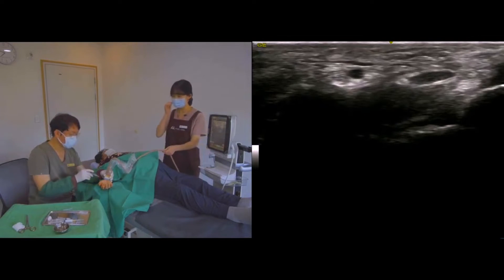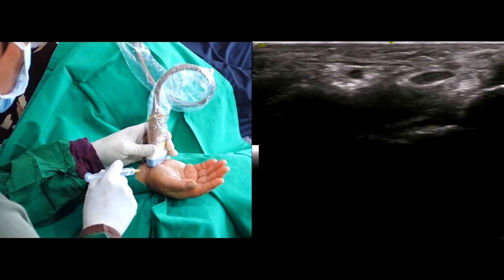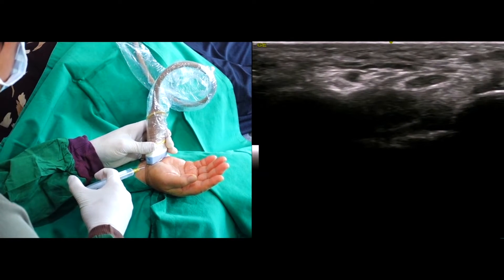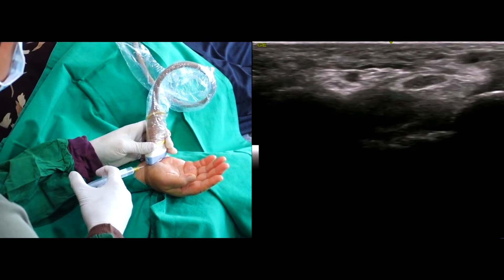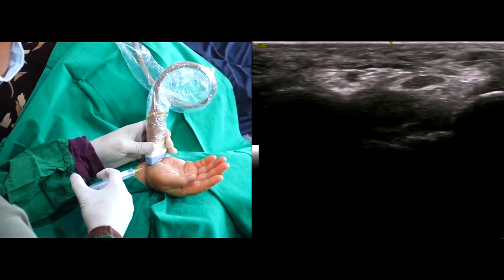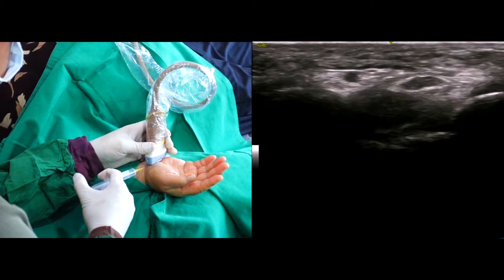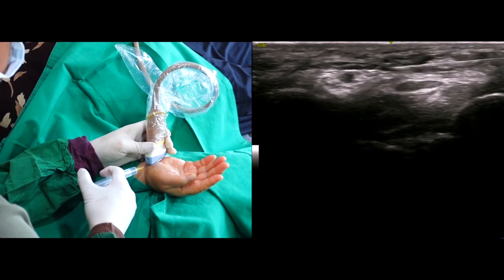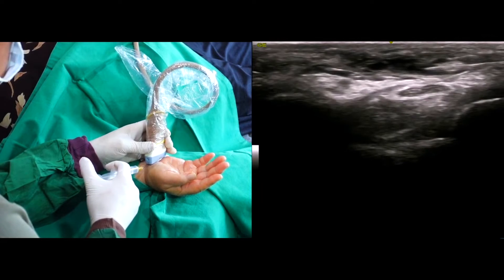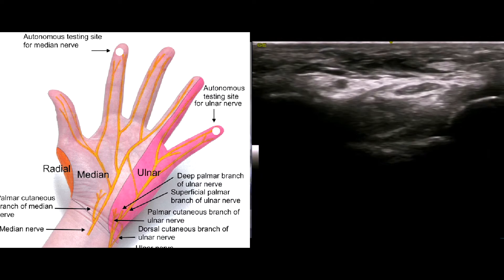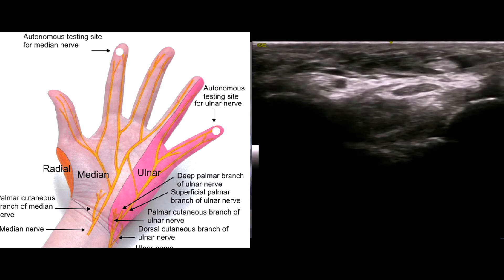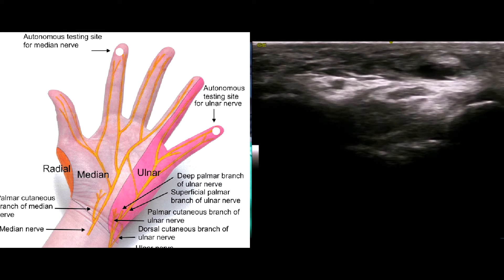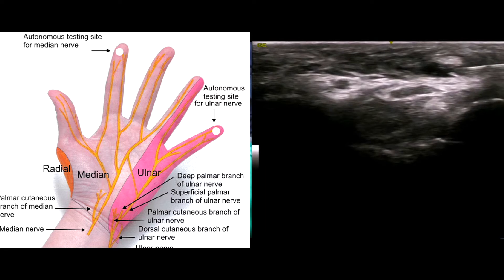Let me begin. It will sting. I will anesthetize the skin and subcutaneous tissue before the hydro-dissecting procedure. The surgical site is innervated by the palmar cutaneous branch of the median nerve, and the nerve arises from the median nerve main trunk proximal to the wrist crease.